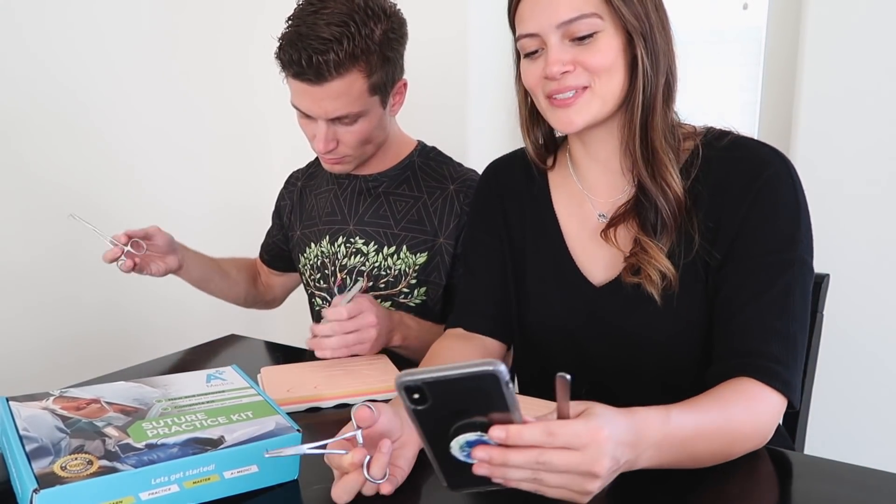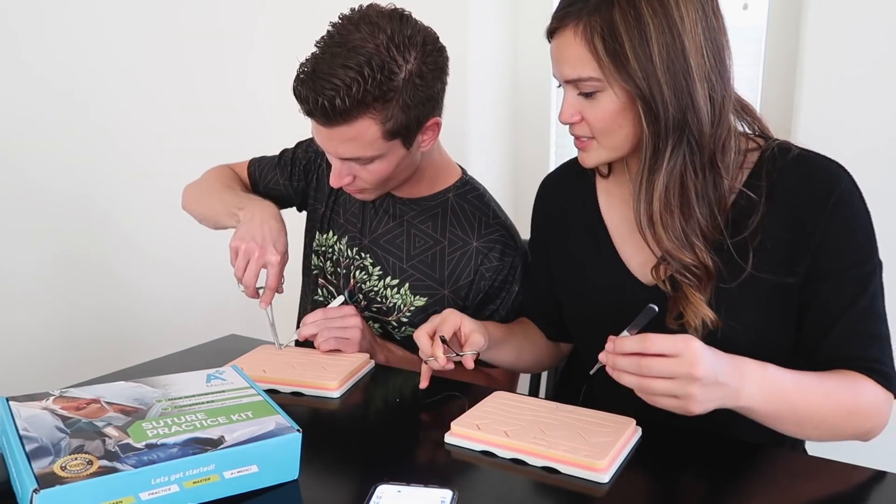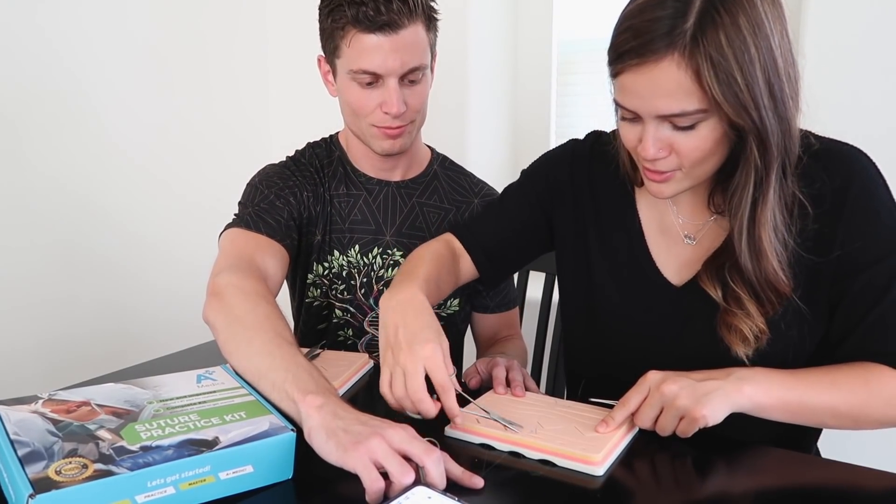Christelle asked: how are you both so awesome? Hey Christelle — she's one of my classmates. Wait, what's my next step? What do I do? Oh boy, poor patient. Sorry patient. Brace yourself.